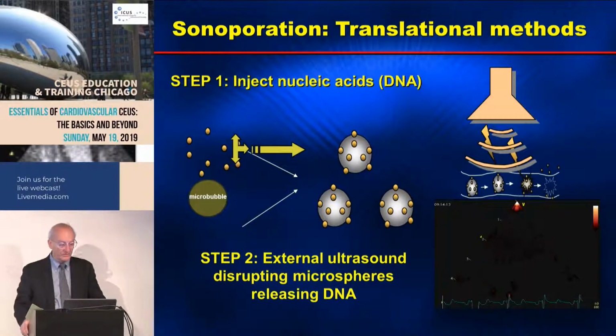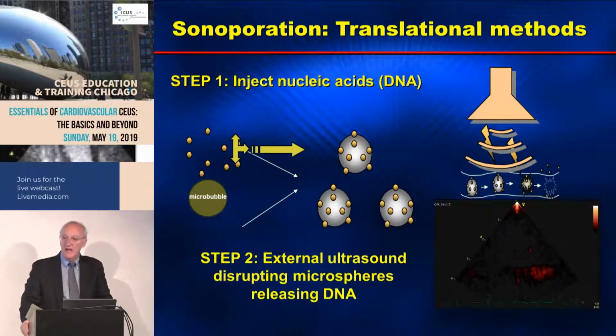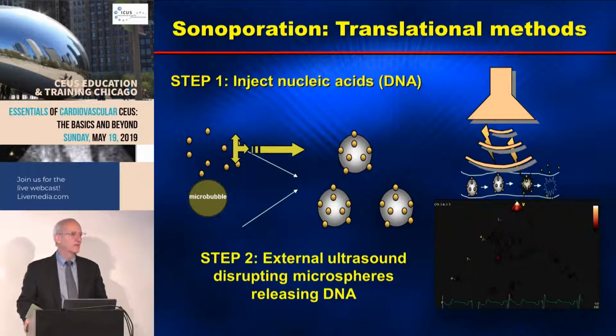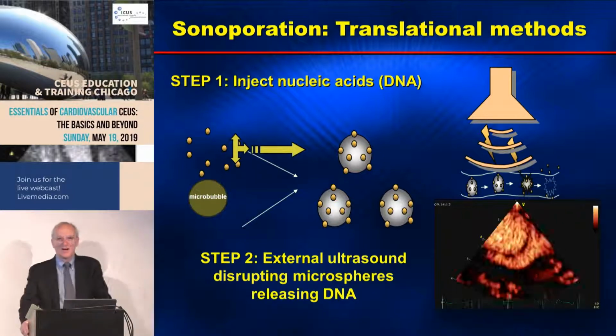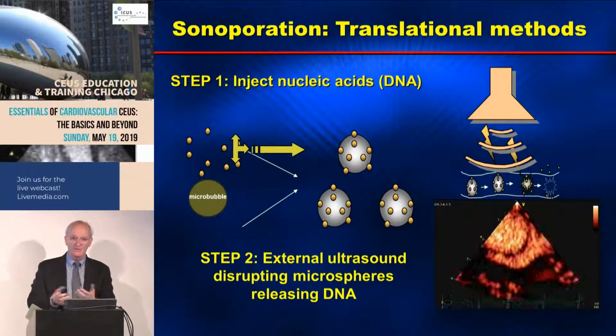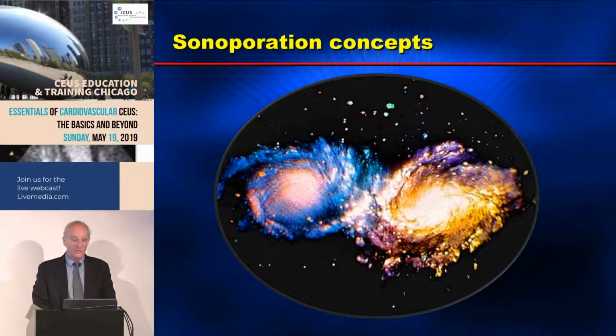Let me show you. This is a picture how simple it is. You have your microbubble here on the left. You put your load on it. You then do an ultrasound beam, and you can see what the ultrasound beam does. There's a full picture, and it disrupts them. We don't say destroy, we say disrupt. Generally, the genes and drugs are near or on the surface, so we don't really care if they're disrupted. Why? Because let's show you what is the concept that we're actually doing.